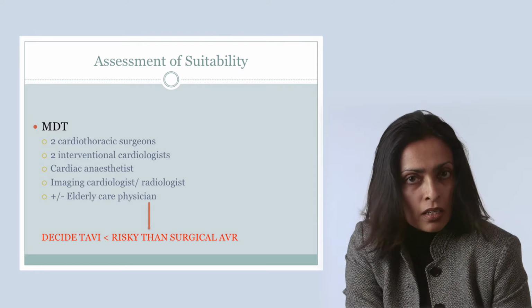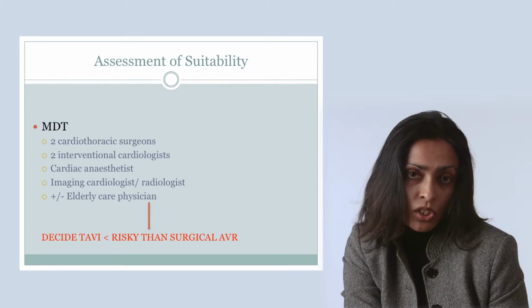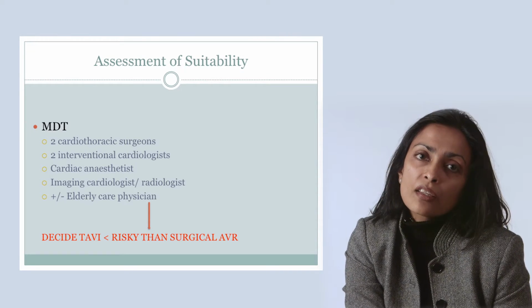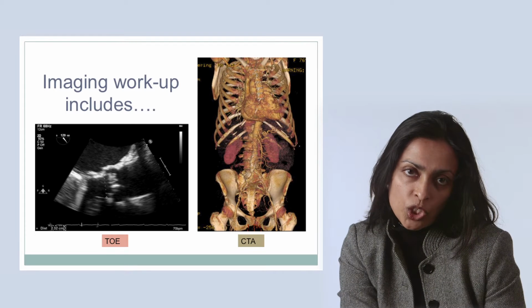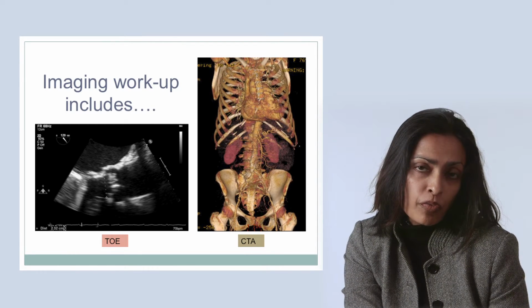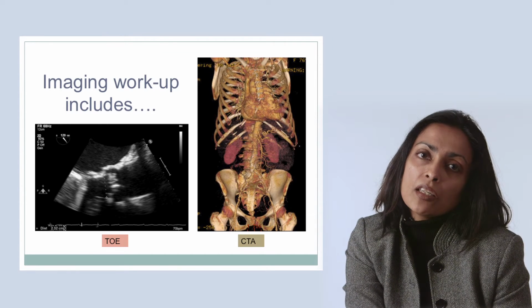The MDT consists of 2 cardiothoracic surgeons, 2 interventional cardiologists, cardiac anaesthetists, and cardiac imaging specialists. Imaging workup pre-procedure includes TOE, which is transesophageal echocardiography, and cardiac CT.